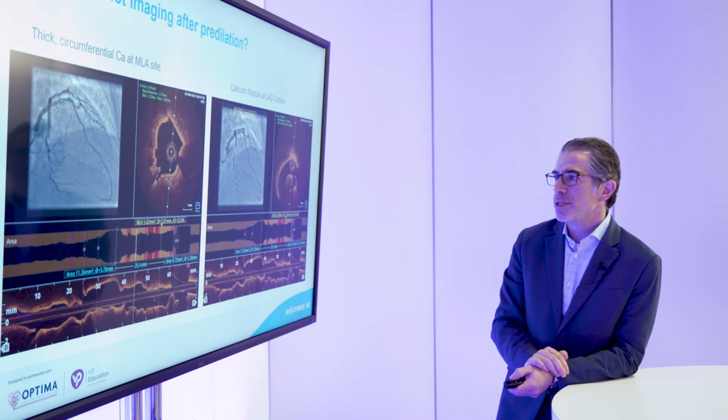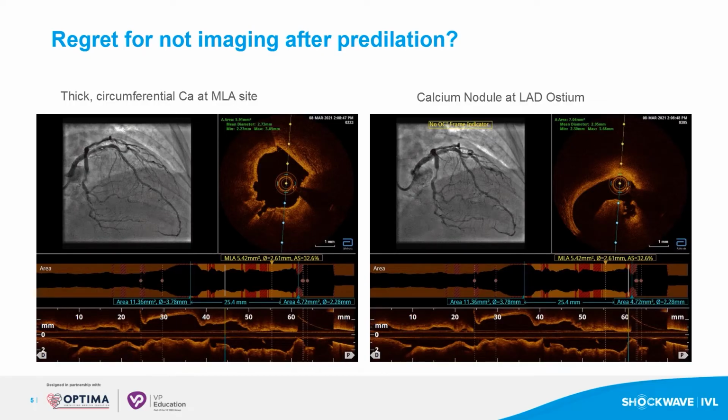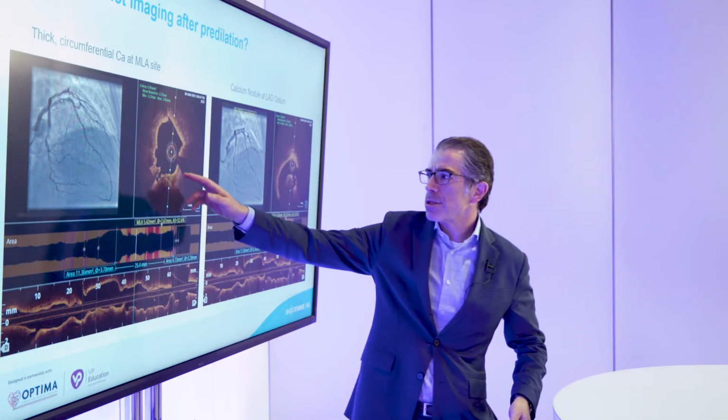I then did OCT afterwards to optimize my PCI. Some interesting findings. First, in this view here, I'm in the proximal LAD. You see classic fractures, multi-point fractures.